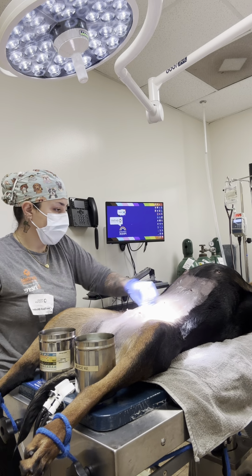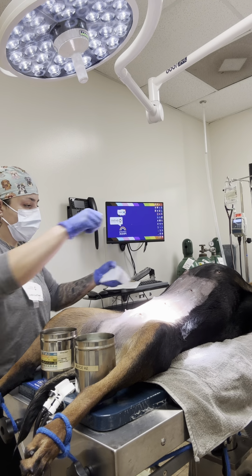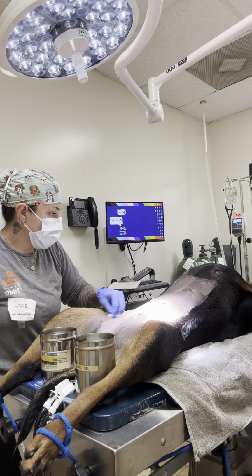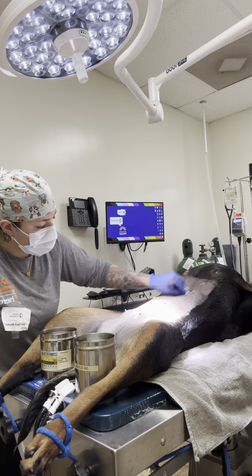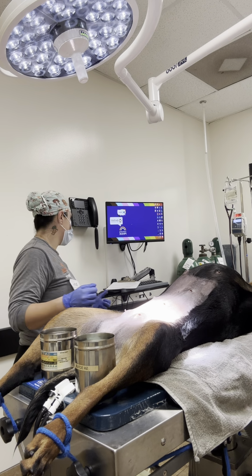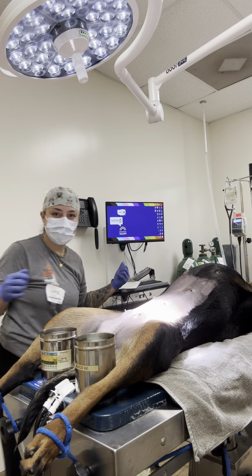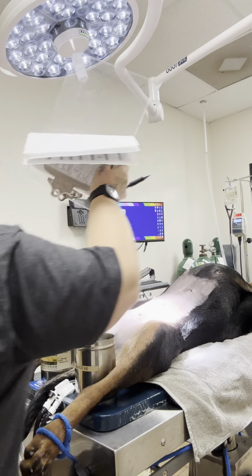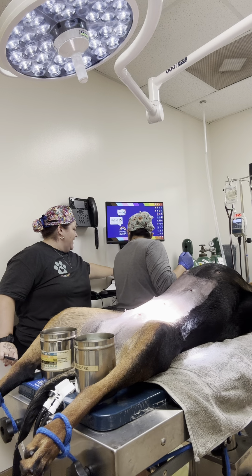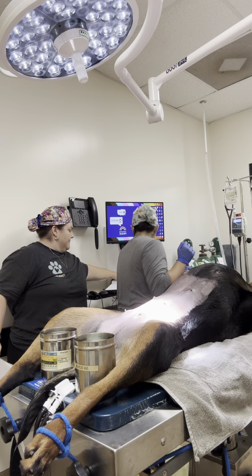Oh my god. Can you turn this page for me? I'm gonna come on this side. It's too far. I just want to make sure I'm not missing anything after the scrub. Thank you. Circular motion for the process.